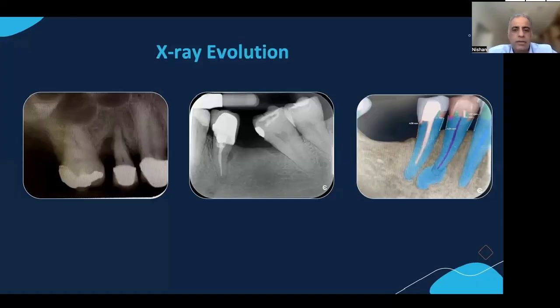And again, going from 5 minutes processing now to seconds. The next logical step then was AI technology to read those digital X-rays, and we purchased Pearl around about June, July, and have been using it since to great effect.